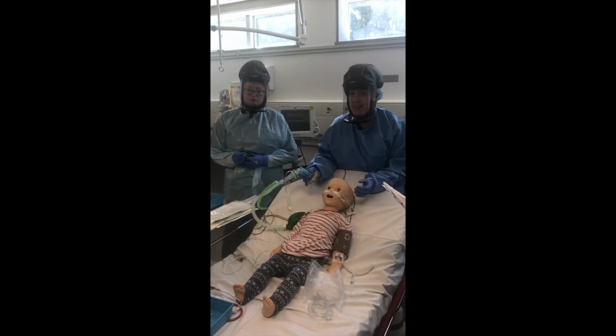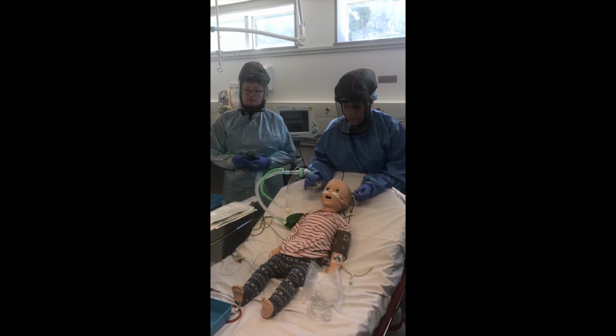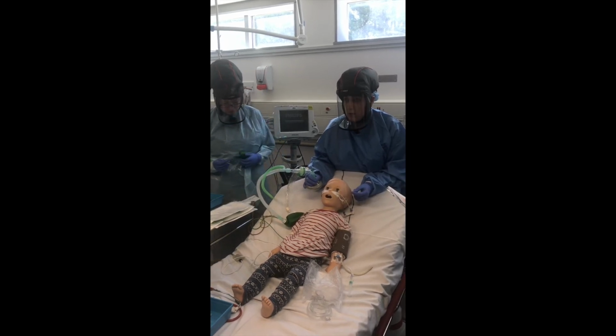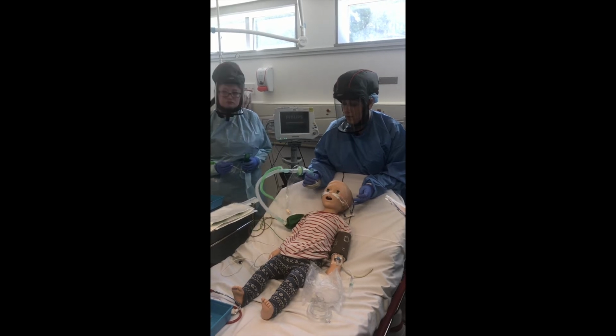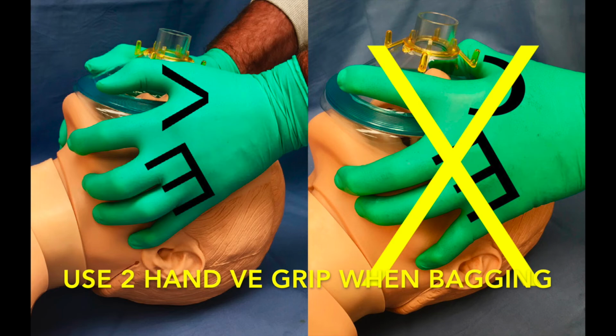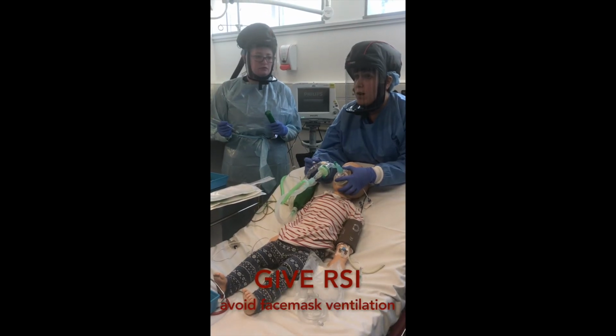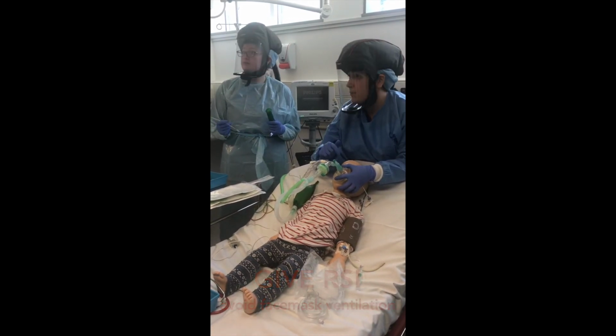If you have your face mask, inline suction, HME filter, capnography. Okay, so when ready, you will remove the high flow nasal oxygen. Bagging circuit you're happy with, consider adrenaline and fluid bolus. So can someone time, once the rocuronium is in, we need 30 seconds. Okay, I'll time.